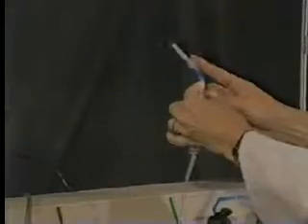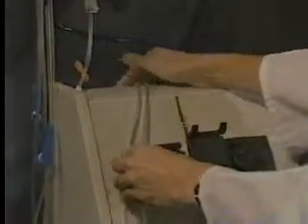The return saline line has a drip chamber and a needle connected to it. Place the return saline line over the top of the spectra system. We have now finished with the coils.